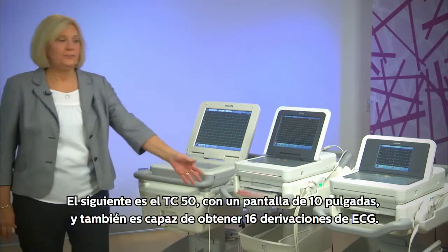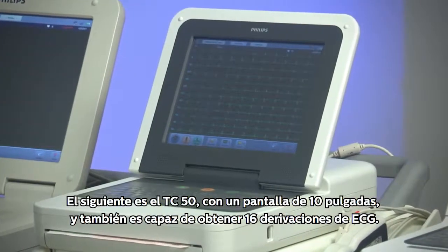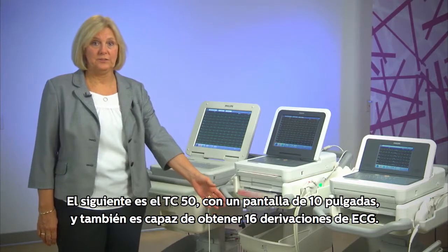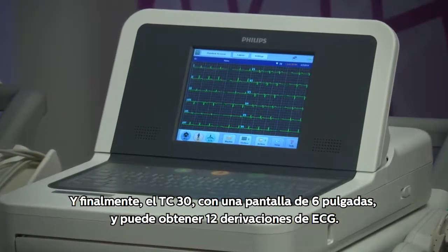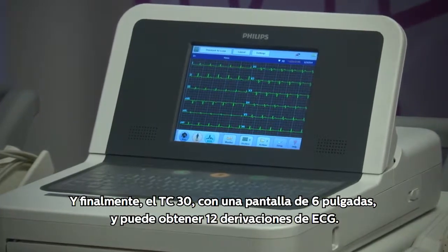Next is the TC-50, which has a 10-inch screen and is also able to acquire 16 leads of ECG. And finally, the TC-30 has a 6-inch screen and can acquire a 12-lead ECG.